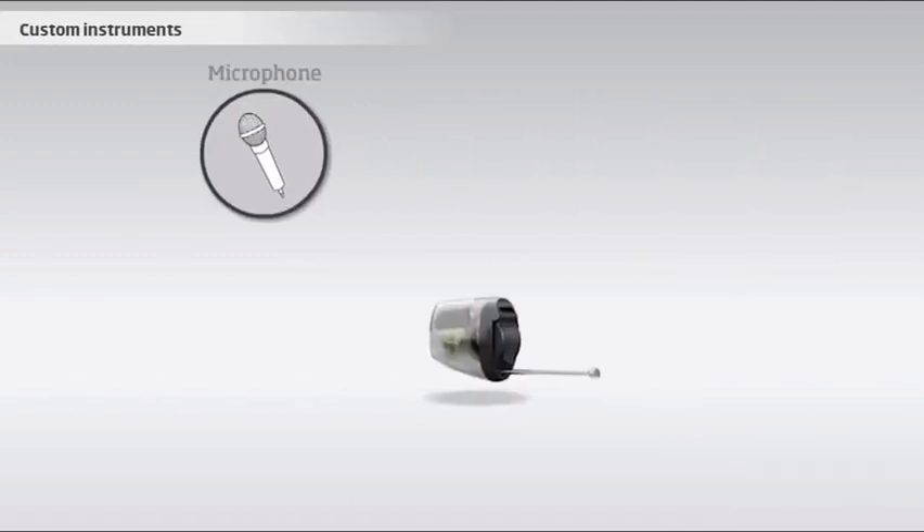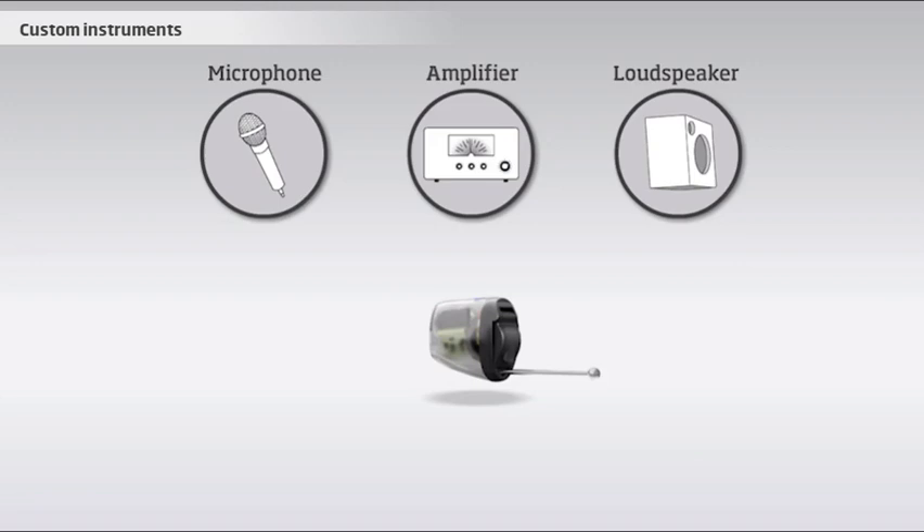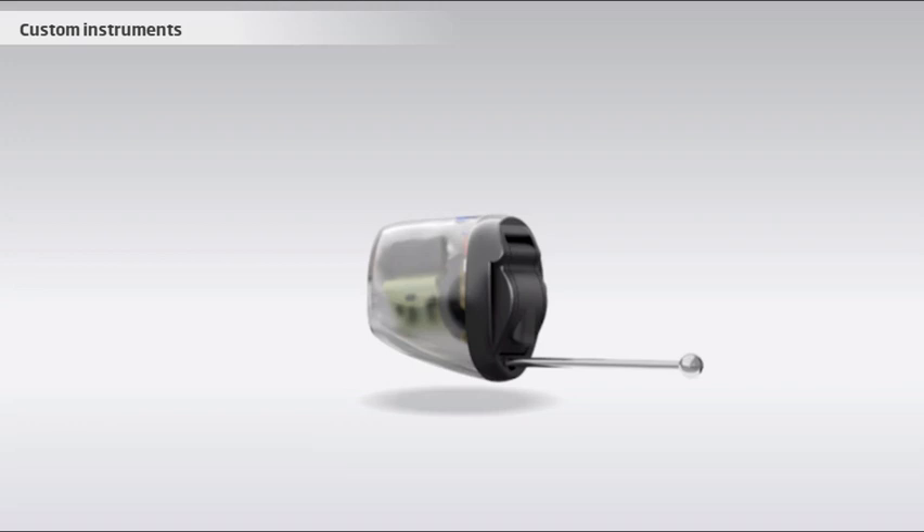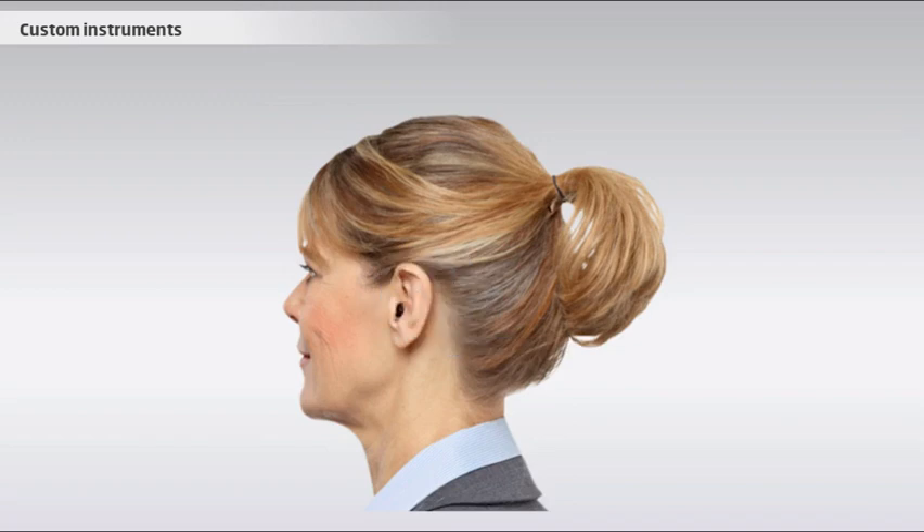In custom instruments, all components are modeled into a shell, which is made based on an impression of the specific ear. This type of hearing instrument sits directly in the ear. Therefore, it requires a sufficiently large ear canal.